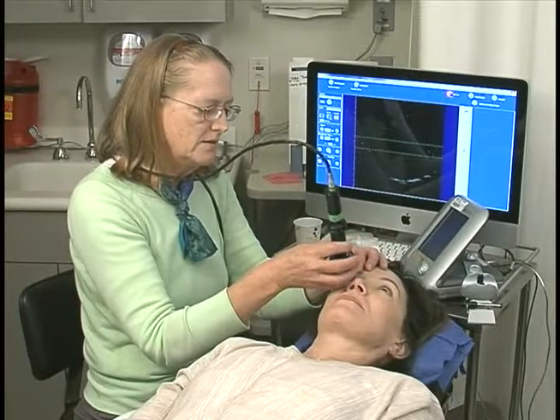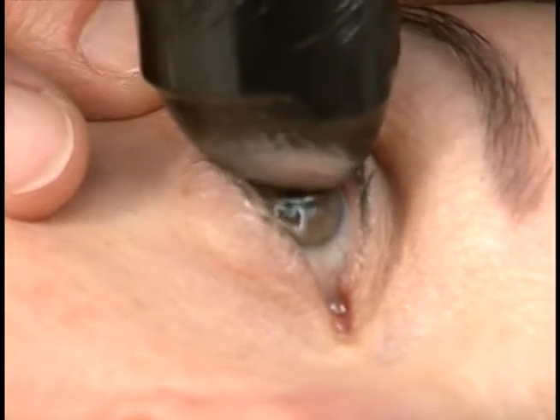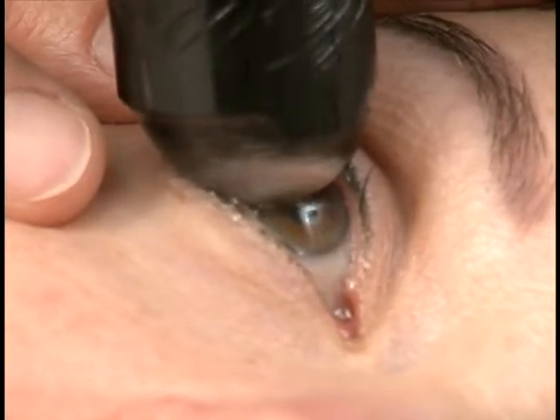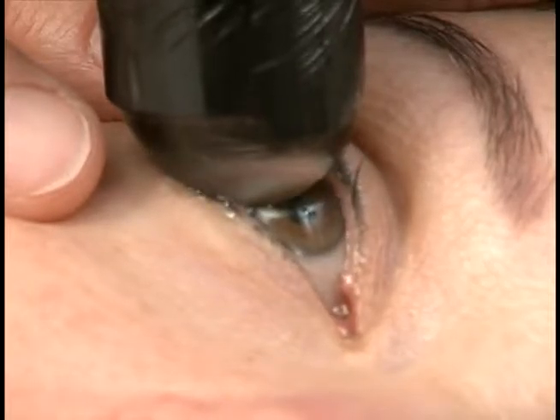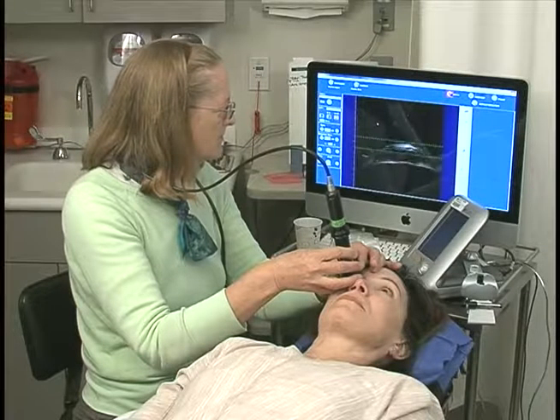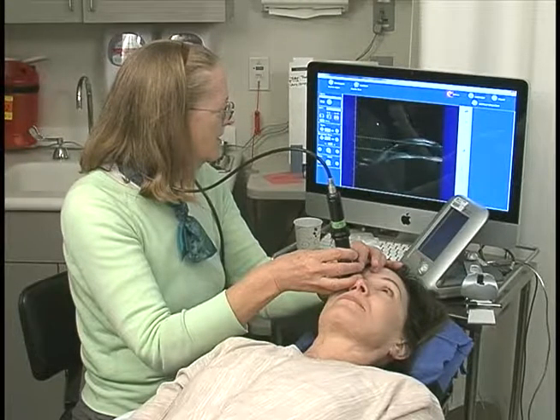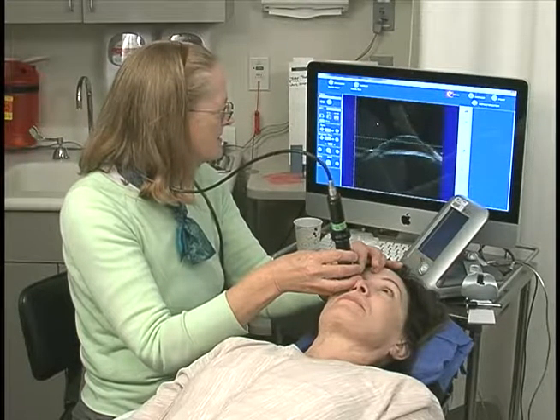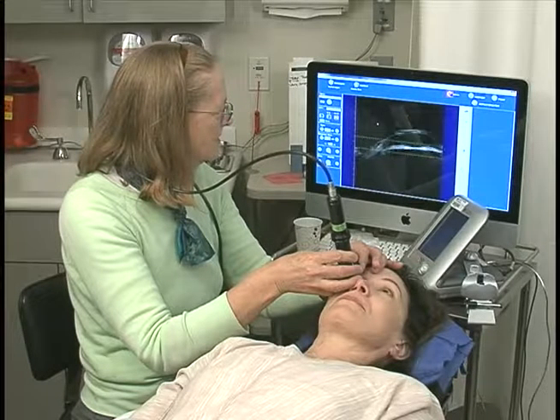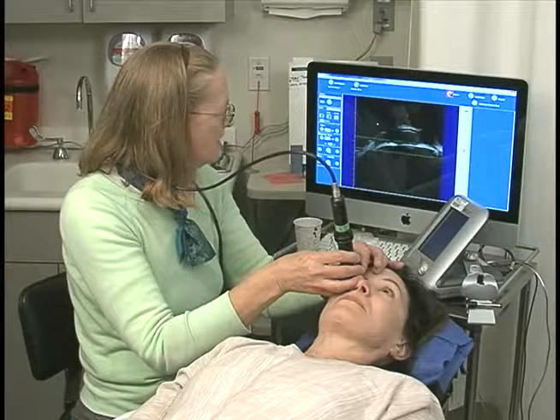and I do an axial scan, there we see the eye, the cornea, the anterior lens, the iris, and the pupillary space.